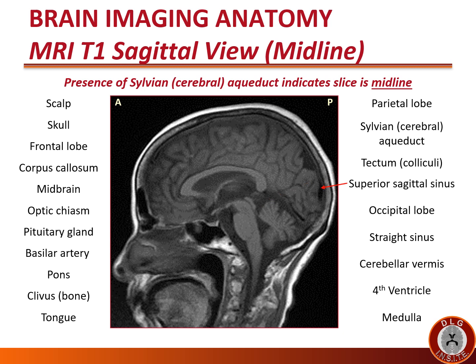The black tube in the midline running just underneath the scalp is the venous structure called the superior sagittal sinus. The posterior inferior aspect of the cerebrum on the midsagittal image is the occipital lobe, lying posterior to the parieto-occipital sulcus. The black tube running just inferior to the occiput and superior to the vermis of the cerebellum, running in the folds of the falx, is the straight sinus — a venous structure that drains the deep cerebral veins.